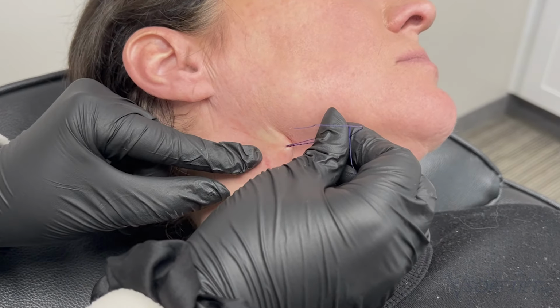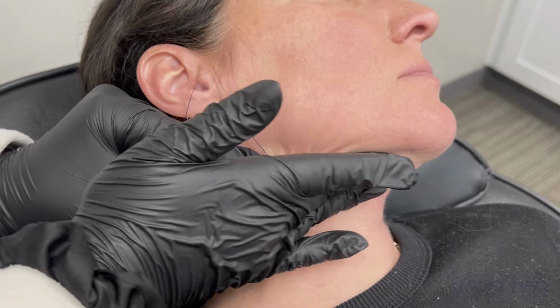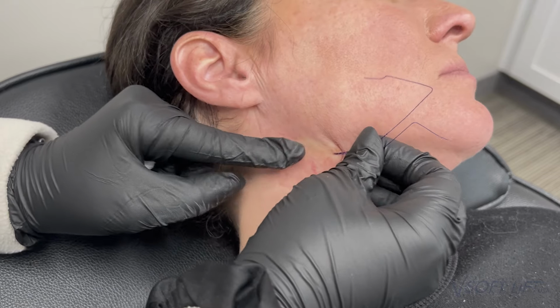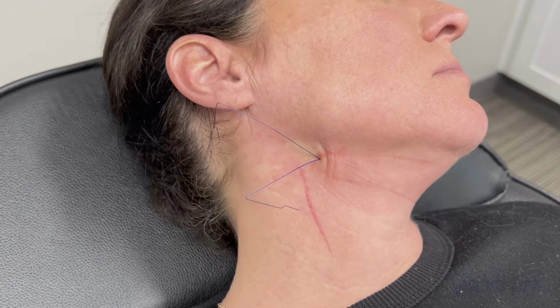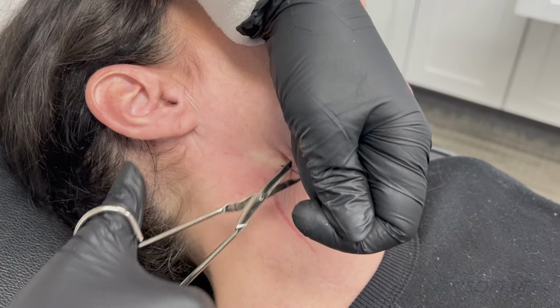And then I typically will always grab the threads in the neck and do a little bit of a reverse pull and try to get it as tight as possible. You actually do want to see that skin bunch up there because we're not cutting off the excess skin, so it's got to bunch up somewhere.